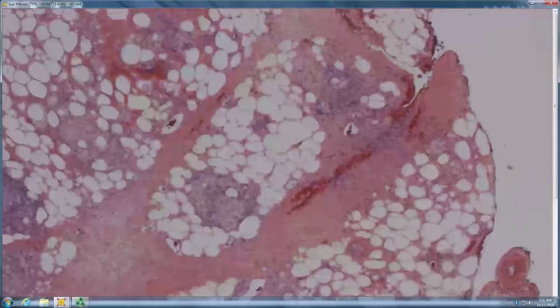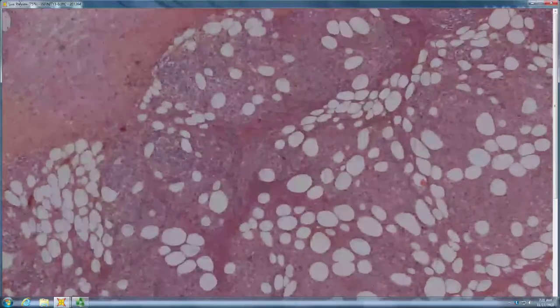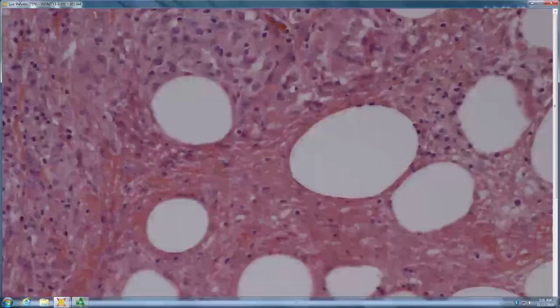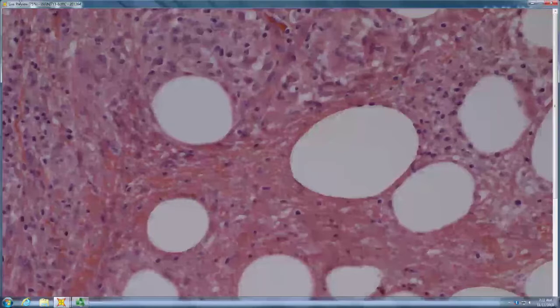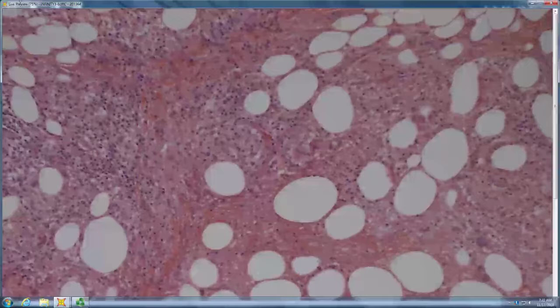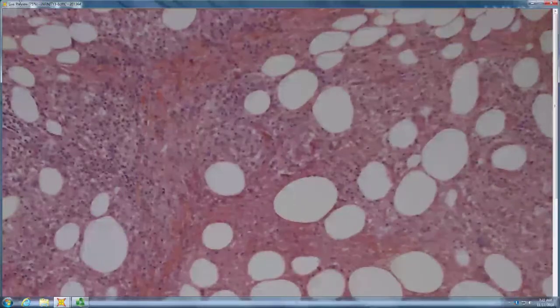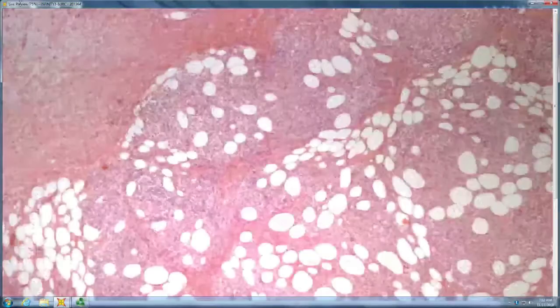Looking for like a beanbag cell. Well, so beanbag cells would go with what? I would go with cytophagic histiocytic. So beanbag cells would go with cytophagic histiocytic panniculitis, and is that something that ends well? No. How does that end? Hemorrhagic death. You sort of hemorrhage from every orifice, which is not a very nice way to go. There's definitely fibrin in here. Not quite caseous, but sometimes it's more caseous than fibrinous.